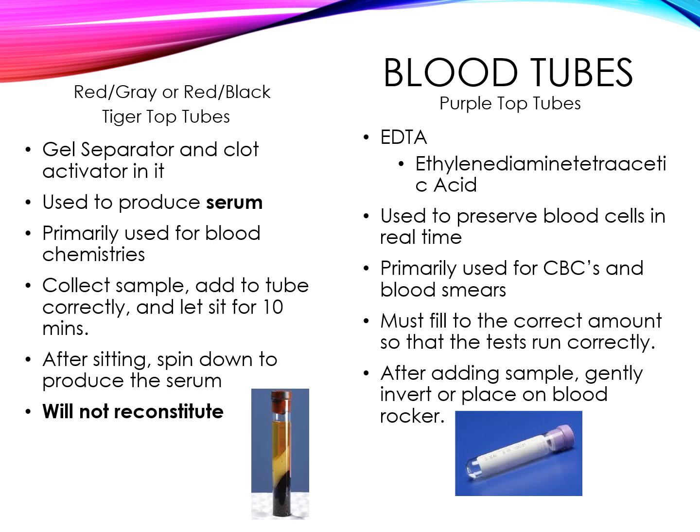When you pull blood into these tubes, you're going to collect the sample and add it to the tube either through the vacutainer or by taking the top off. And you're going to let the blood clot first before you spin it down. Depending on the species, for example, horses' blood takes a long time to clot. But generally, most blood clots within about 10 minutes, and then you're going to spin it down.